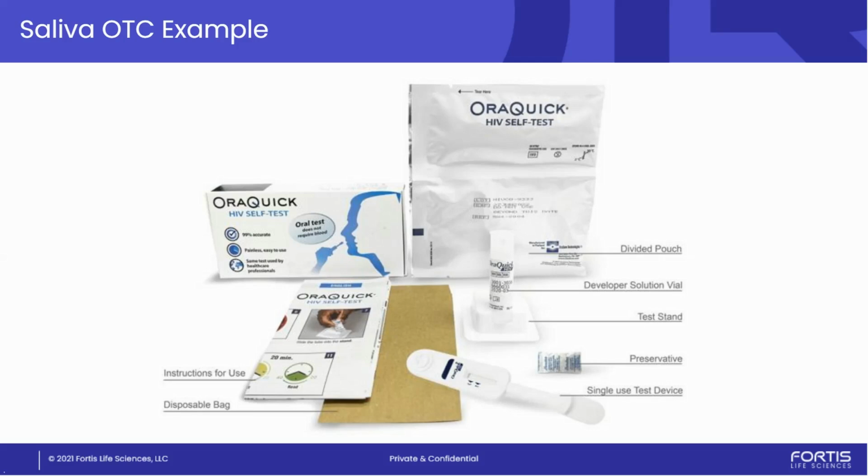And included with that sample processing is the solution vial. So this helps extract that protein so it doesn't bind and stick to the sample pad before it hits the membrane. So they have some extraction or running buffer that helps with the flow, helps with the collection process. And that's something that will also have to be considered as part of your product development.